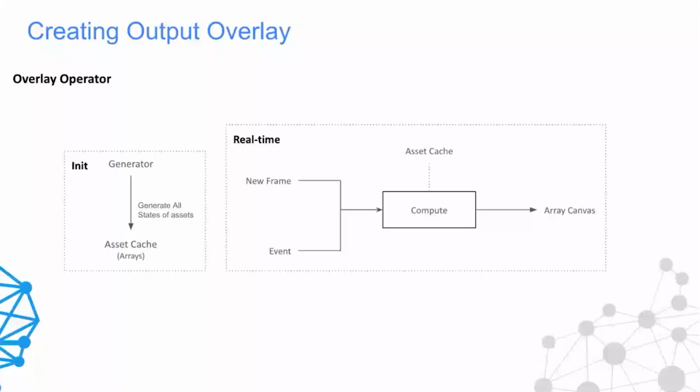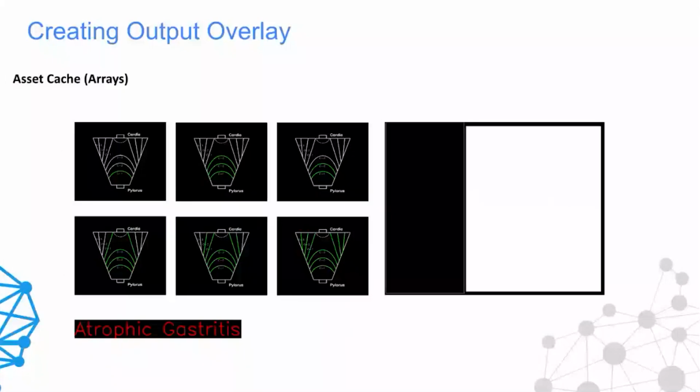These are cached in an asset cache. During the real-time execution, when the compute of the overlay operator is executed, it combines the asset cache information with the dynamic content that it wants to show and creates an array-based canvas that can be overlaid on top of the live feed. So the example that we saw previously in the video, these are the states that we create for each and every object, and then we cache them so that we can just quickly replace them during runtime without having any overhead of creating the overlay output.